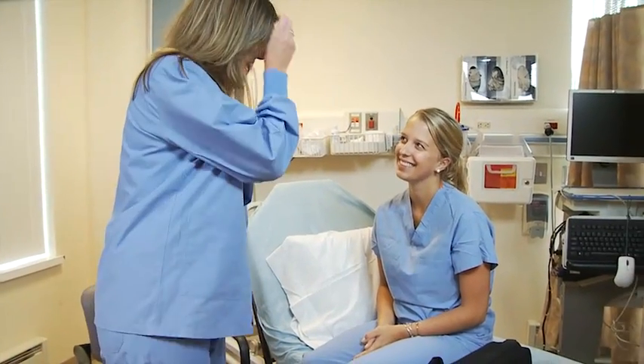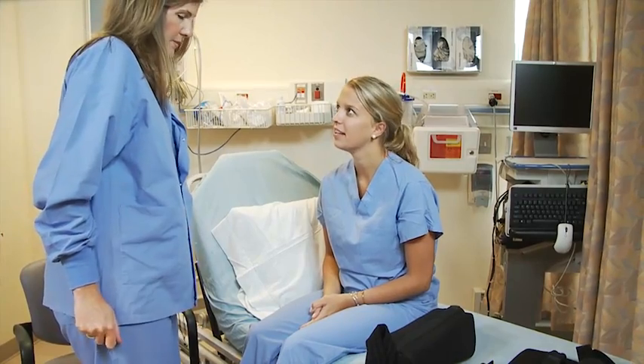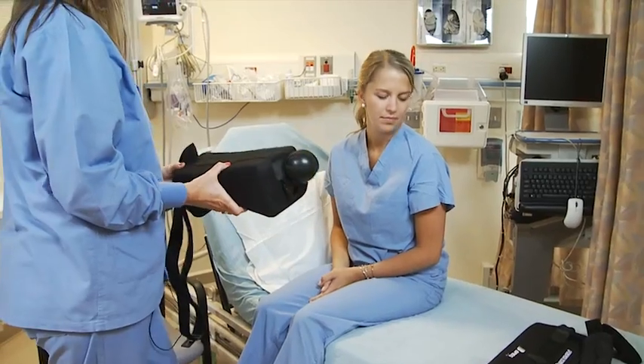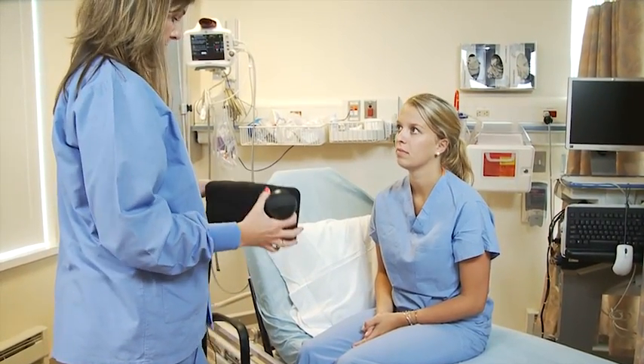Hi Sarah, it's Mary Beth. I'm going to show you a couple of different slings that you may be going home with. This is the sling you would typically be going home with if you had your rotator cuff done. This is an abductor pillow.